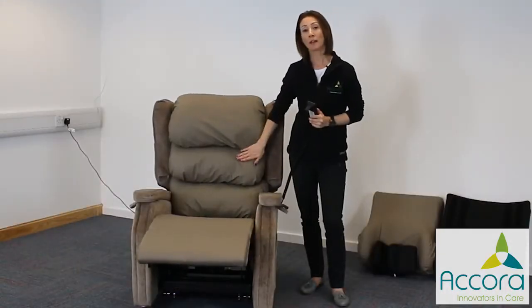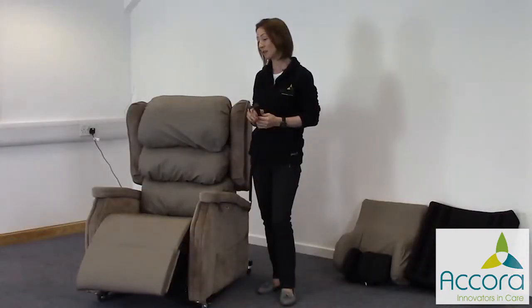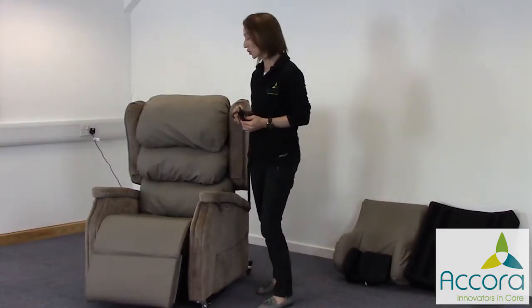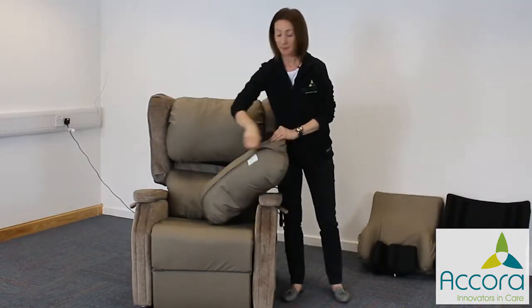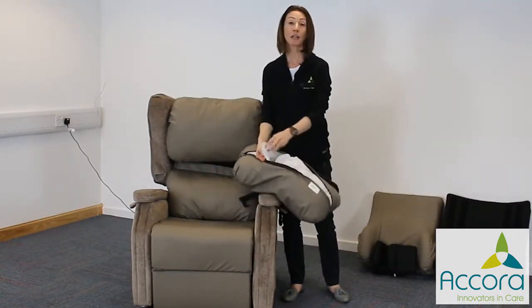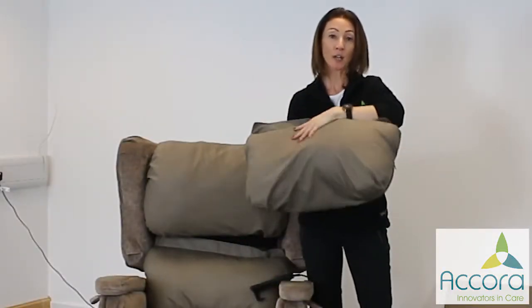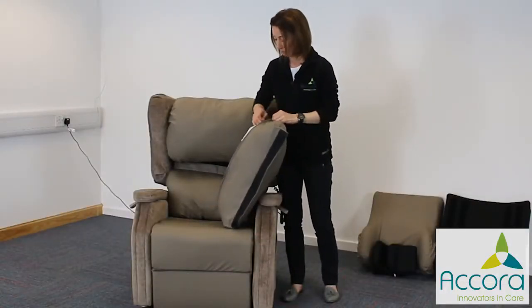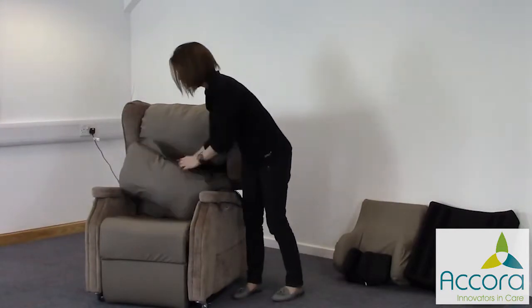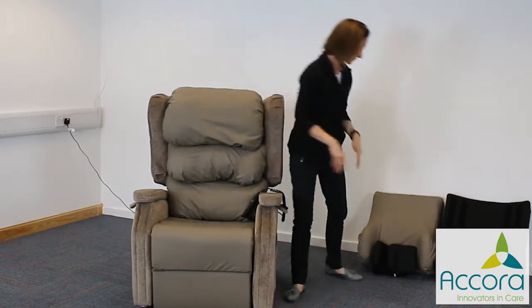With the Waterfall Backrest, we can accommodate some of the person's postural needs by removing some of the stuffing or readjusting the stuffing within the cushions. We can remove the cushion, open the zip, and here the stuffing can either be removed or positioned according to a person's needs. I can move this to this side to provide more support. I can then replace the cushion.